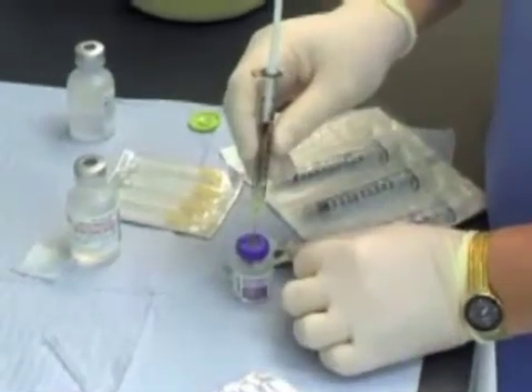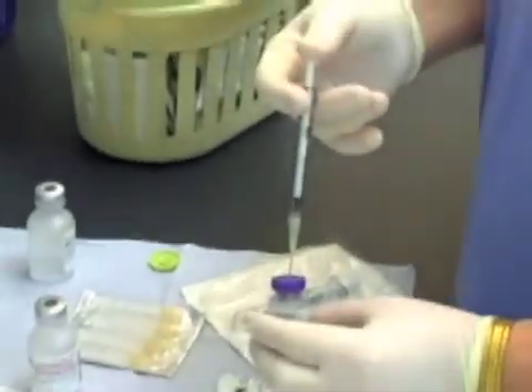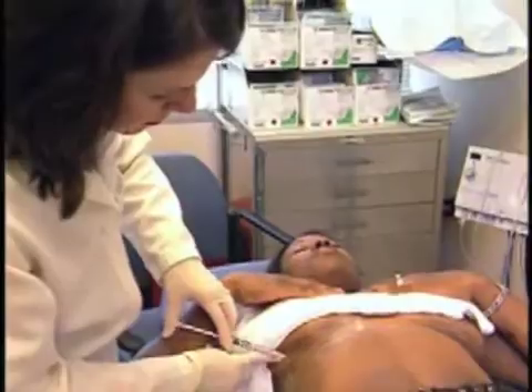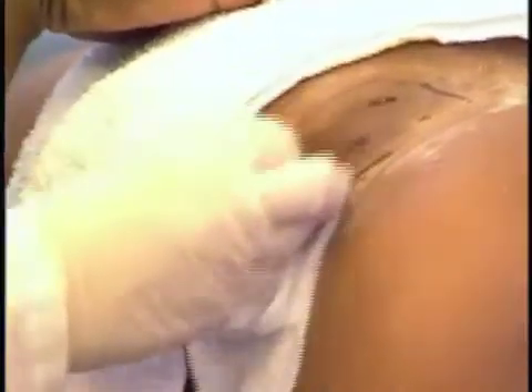Outline the area with marker if necessary. No anesthesia is necessary for this body site. Reconstitute a 100 unit vial of Botox brand Botulinum Type A with 4 cc's normal saline. Use 1 cc luer lock syringes to draw up the Botox and attach a 30 gauge needle.